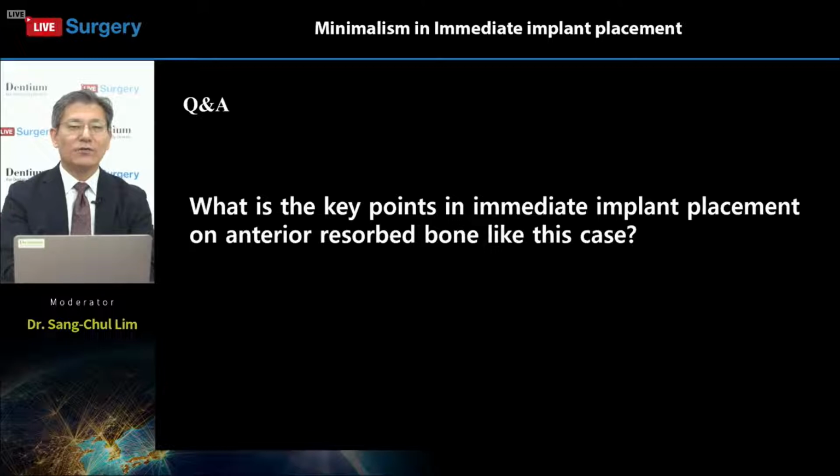Gap filling means when you have an intact socket, the gap filling procedures can be applied. However, the damaged socket, the socket wall destructed, the labial bone socket destructed or some another place, we need collagen membrane barrier before the bone grafting, right? The key is damaged socket or not. We have to consider the damaged socket to go away this way, and the intact socket to go easier way, right?